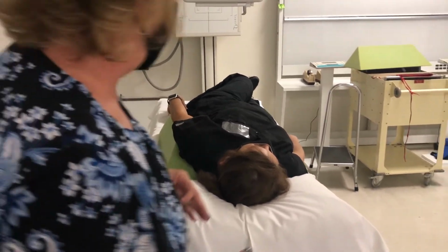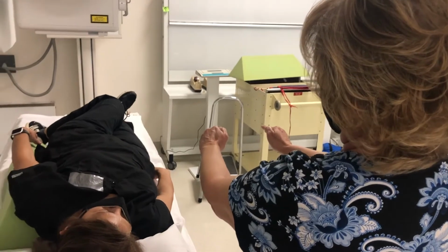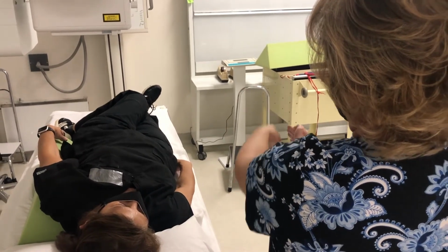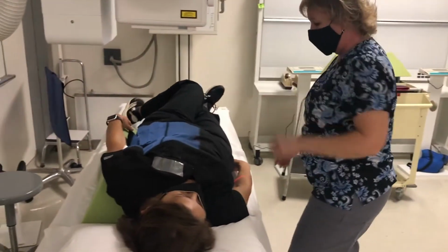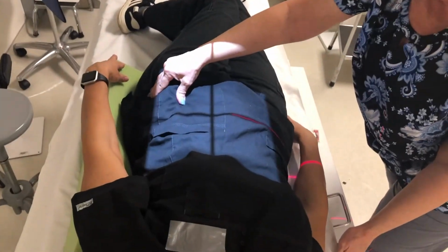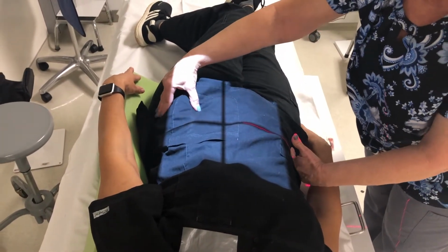This is just an estimate, but what this does is normally the kidneys sit in the body about like this. So when she's rolled RPO, this kidney is in profile and this kidney is lateral, and you can see the ureter coming off. So that's the purpose of the oblique. And I'm gonna be centered at the crest, 2 inches medial to the elevated ASIS, because as long as I'm on the spine, I know I'm at the center of her body.